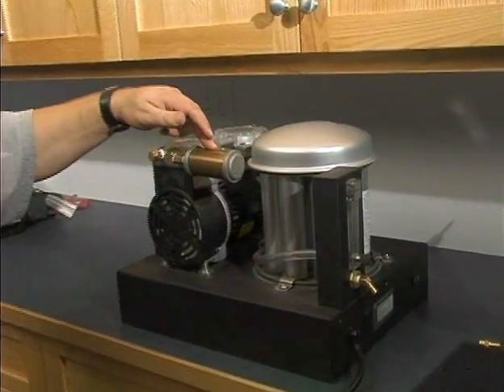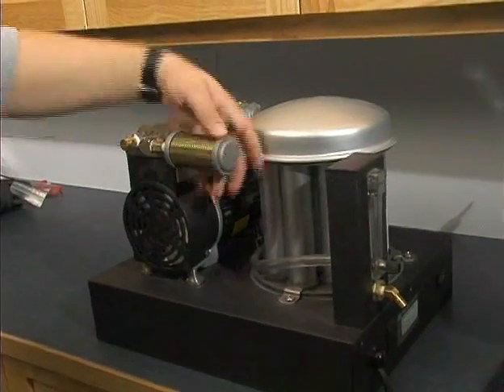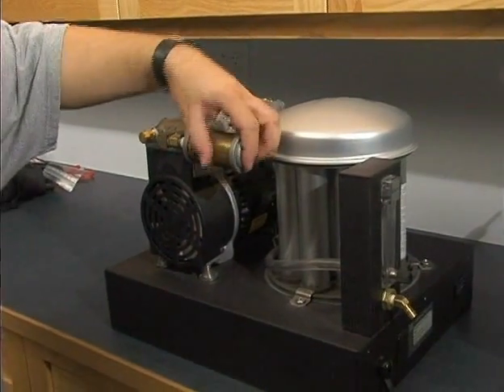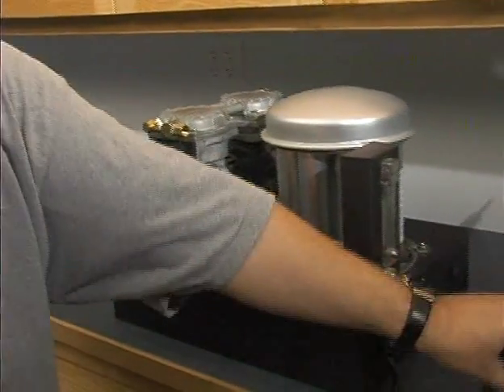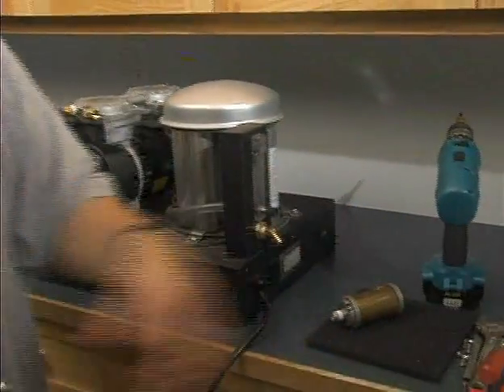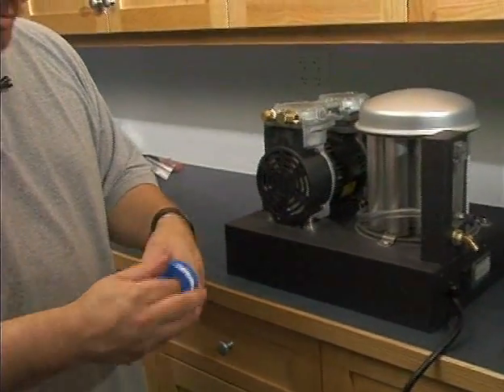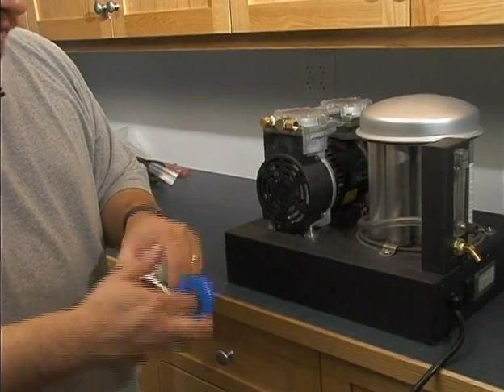Here we have the interior of the oxygen concentrator. The first part to change out is the filter. We want to change it out whenever it's needed — recommended every six months, or more frequently if it's a relatively dusty and dry area that's prone to clogging up filters. Change it out as needed.